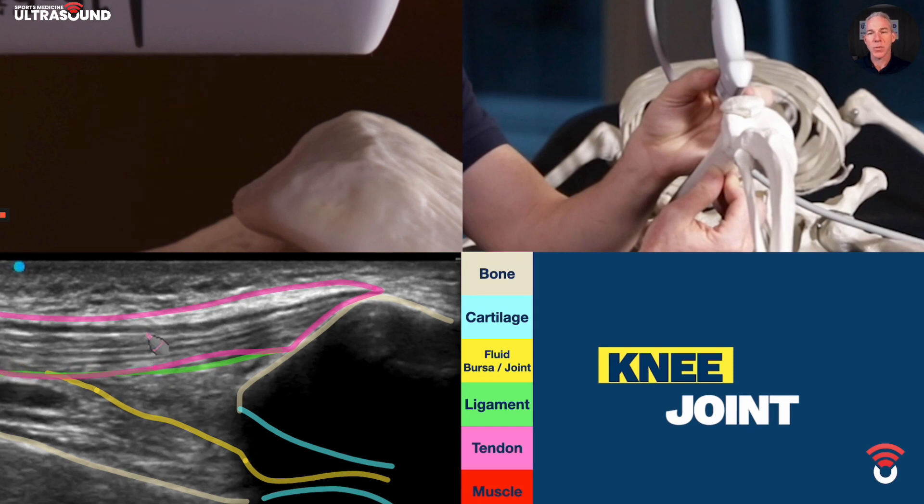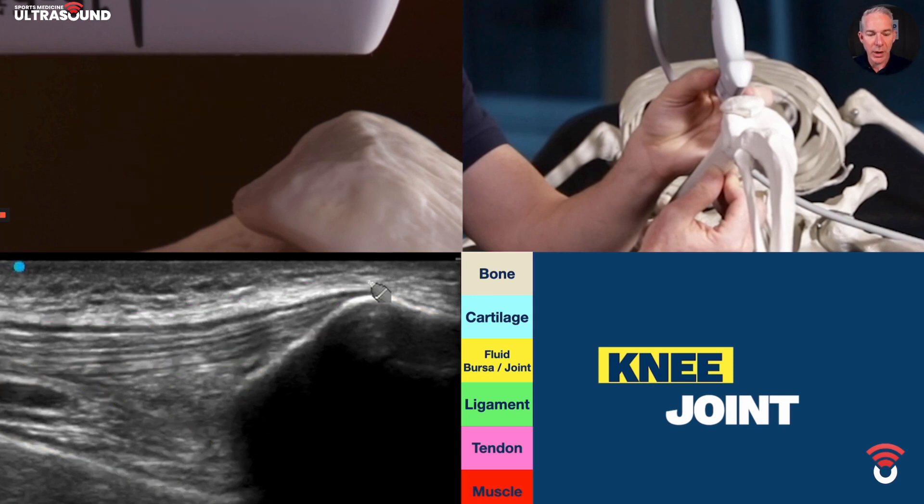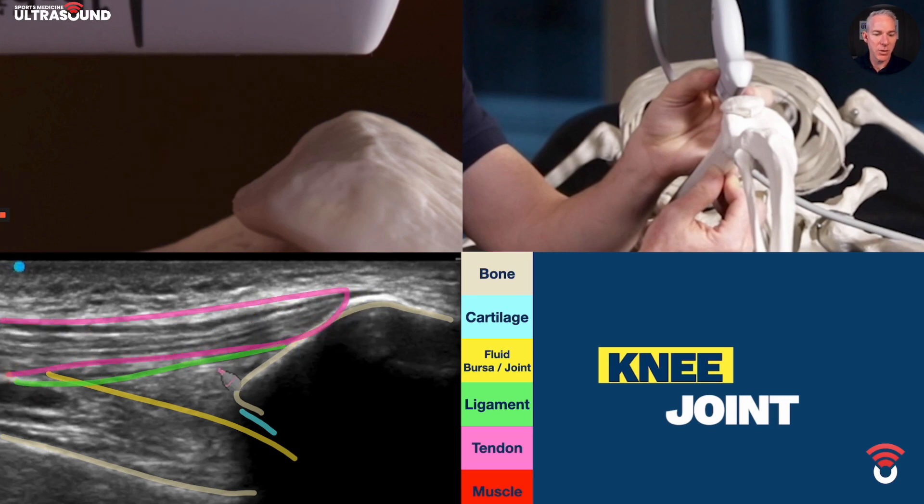And muscle — there's no muscle in view. Let's clear it away and draw it one more time: bone, bone, cartilage, fluid, ligament, tendon — and there's no muscle.